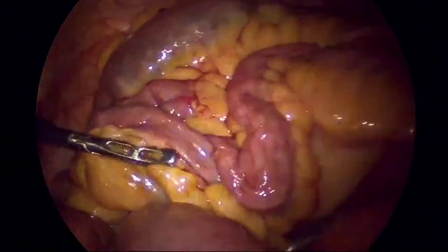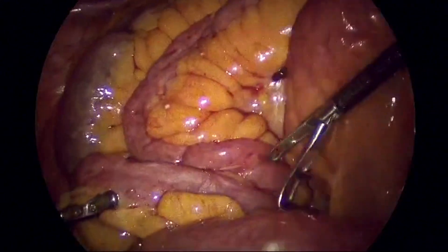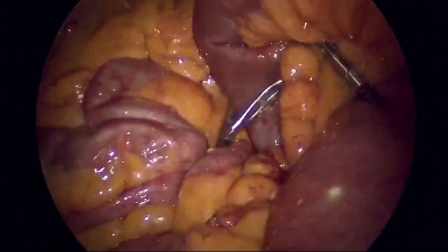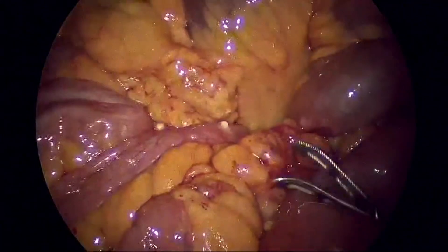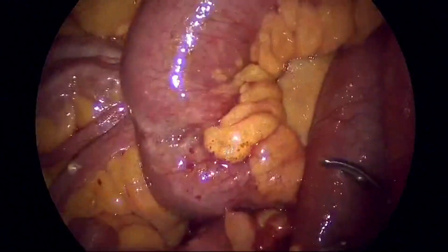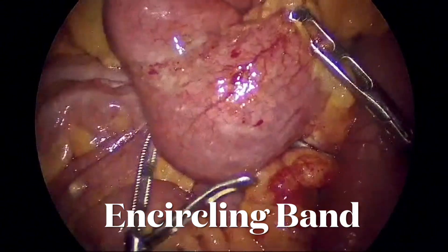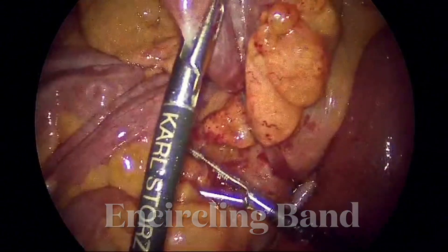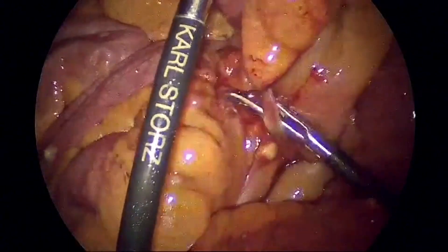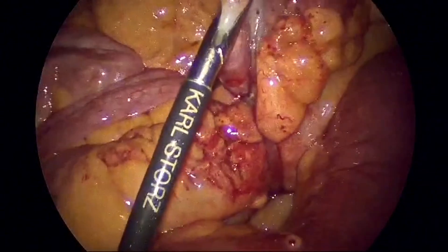We were not able to reach above this area, so we went above and here we could see the dilated bowel loop. This is the actual area of the transition, and here is that band which forms because of the inflammatory process between the nodules and the lymph nodes — a very classical band was seen.